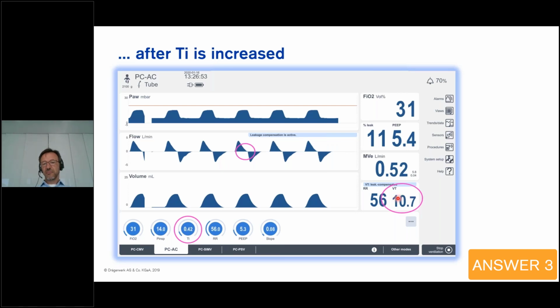Okay, we see maybe after we have done this now, maybe in reality, you could even reduce the pressure because less tidal volume is totally sufficient for this patient. So this gives you the chance possibly to decrease the invasiveness of treatment here.